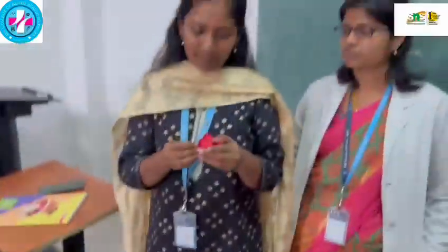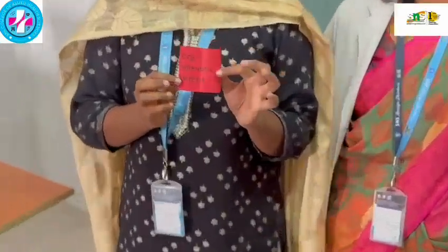Repolarization becomes secondarily abnormal, producing discordant ST-T changes. So I'll explain about ECG diagnostic criteria.